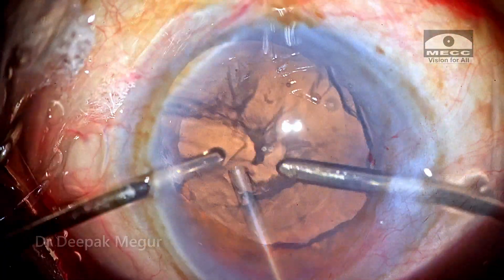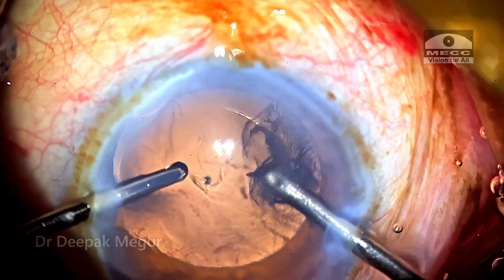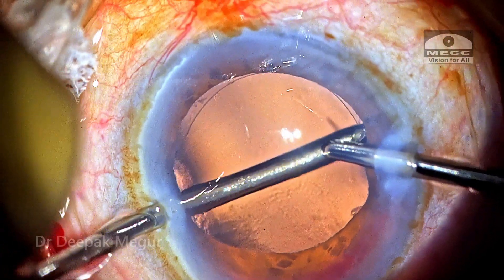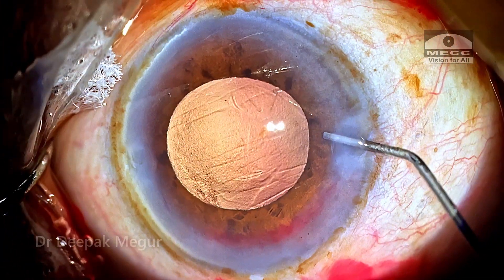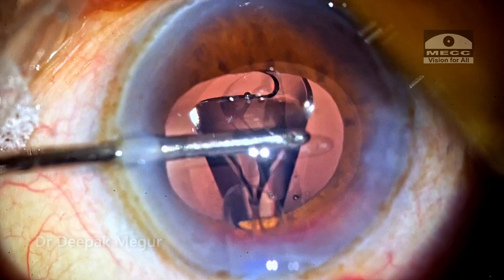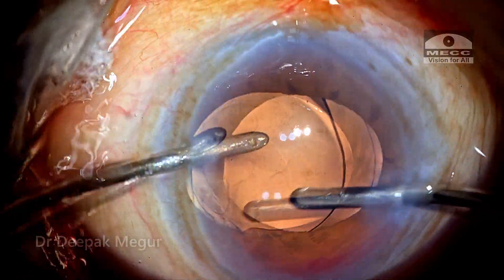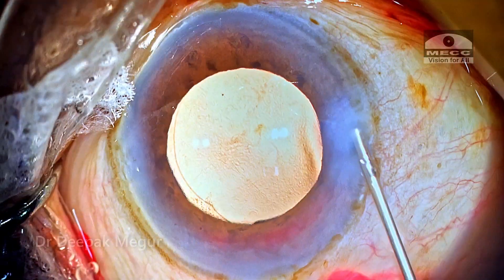Time to aspirate the cortex. Manual irrigation and aspiration is used to aspirate the cortex. A hydrophobic single-piece lens is being placed into the bag. OVD both in front and behind the lens is aspirated out.